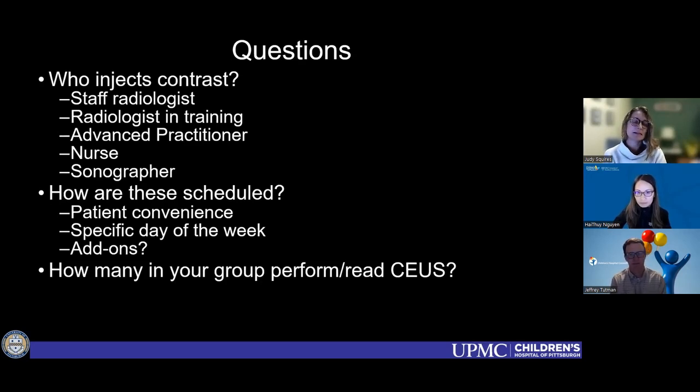So eventually my goal is to have the sonographers give the contrast, just like with CT and MRI, where it's not a radiologist or a physician at all who gives the contrast, although we obviously approve the dose. That would be my goal one day. Yeah, it's definitely an interesting logistical hurdle to figure out how to address.